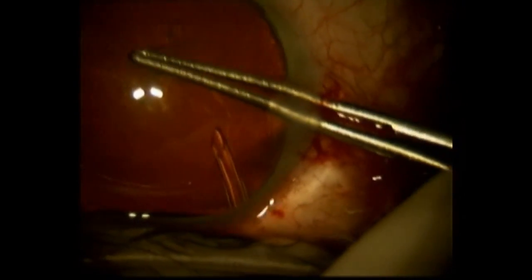I'm removing the capsule here in preparation for cataract surgery. You can see the glaucoma filtering tube already in place.